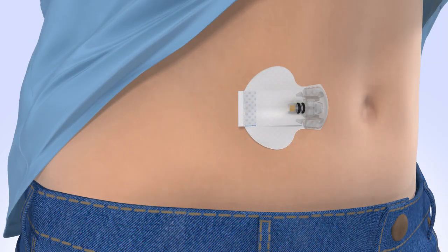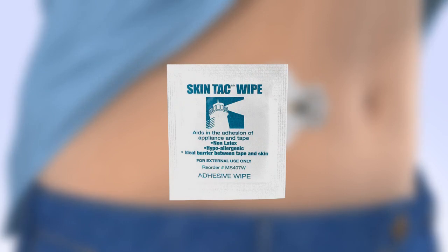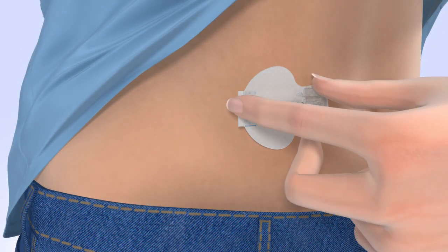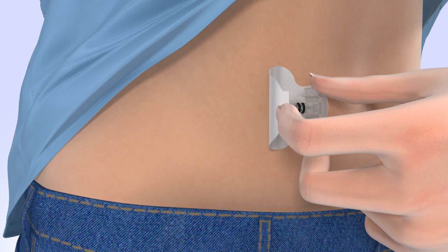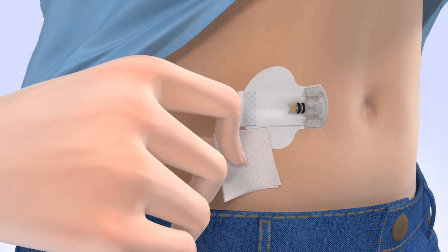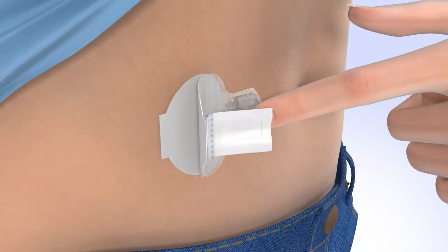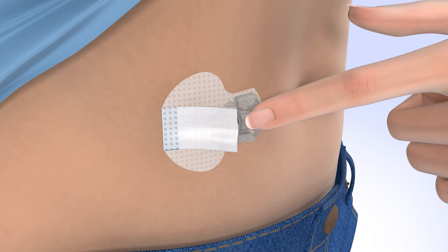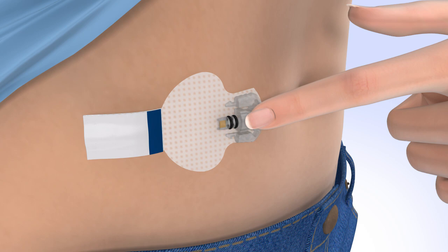Now that your sensor is inserted, you may use an optional liquid adhesive, such as Skintac, to help keep it in place. To apply the adhesive, open the packet and remove the Skintac wipe. With one hand, gently lift the adhesive pad while keeping your fingers on the sensor base to prevent it from pulling out. With the other hand, wipe the skin beneath the adhesive pad. Next, wipe the area around the sensor, including the adhesive pad, and wait for the liquid to become dry and sticky. Carefully remove the liner that is located underneath the curved adhesive pad. Press the adhesive pad against the skin. Now flip the adhesive tab so it lies flat against the skin, but do not remove the adhesive liner from the tab just yet.